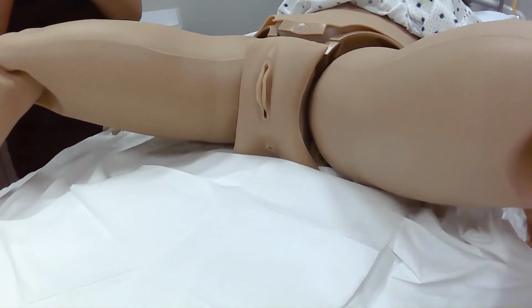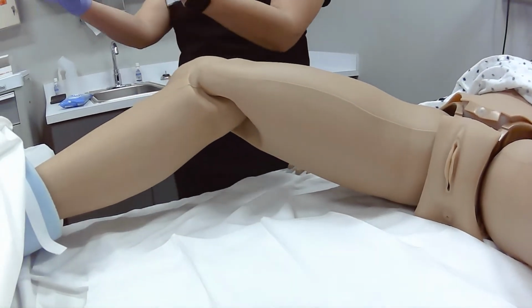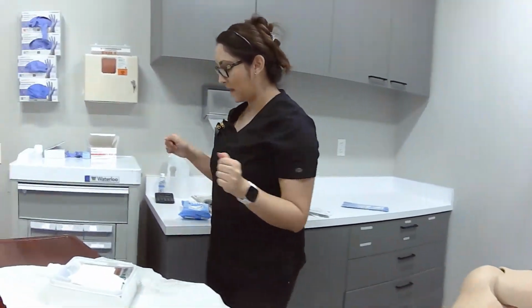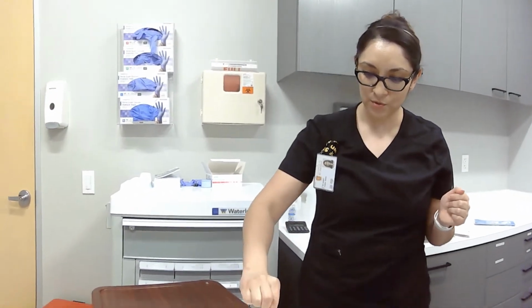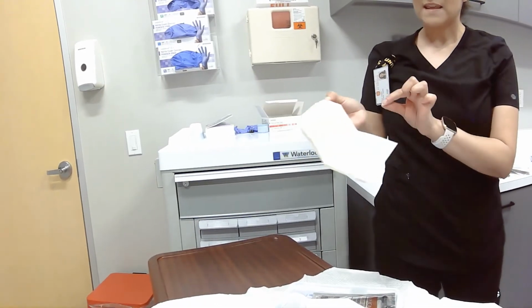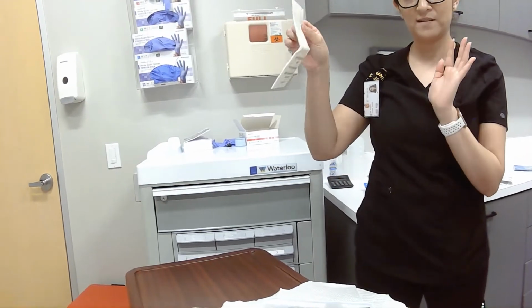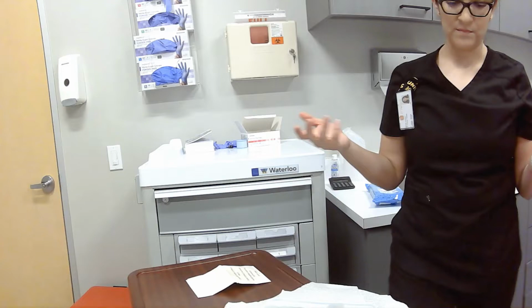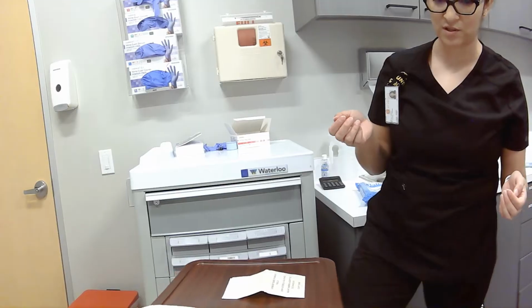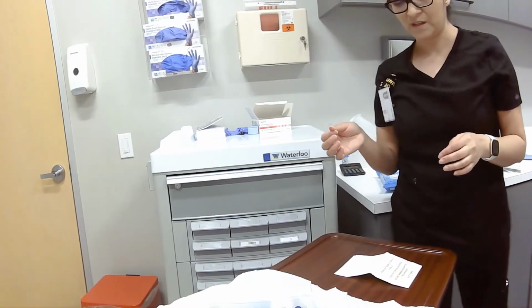Okay, now that that's on there, we're going to put on our sterile gloves. Okay, so I'm going to remove my non-sterile gloves, and then I'm going to do hand hygiene. And I am going to remove the gloves that are in my kit. These are usually mediums, if your hands do not fit into these gloves, you can get custom sizes or sizes that are more appropriate, like small, medium, large, and extra large. So just check with your facility's policies or supplies.